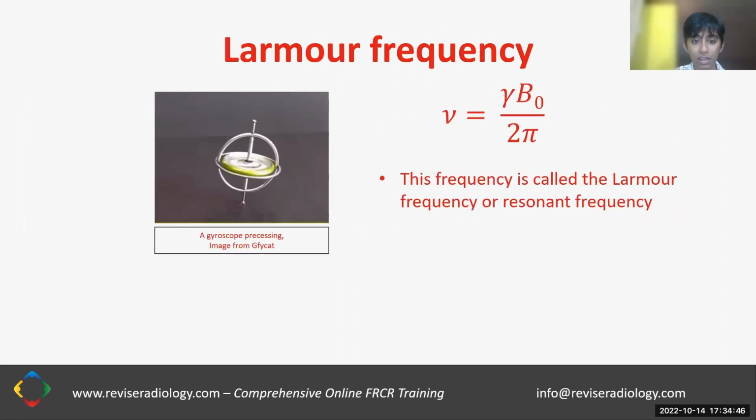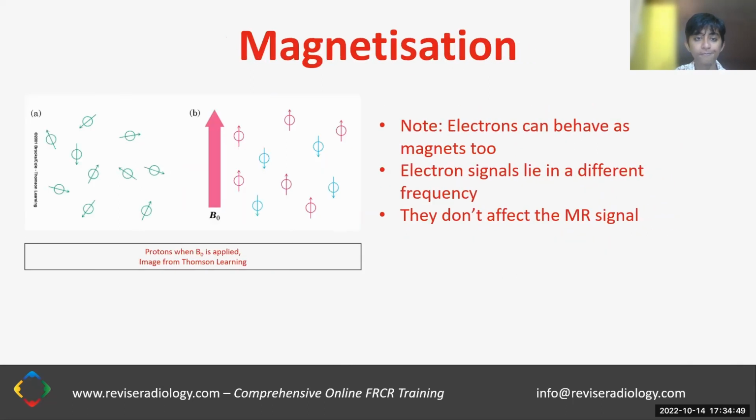Okay, so what happens is we apply a magnetic field. The protons mostly align in one direction, some align in the opposite direction. We apply an RF oscillation, which makes the protons flip up and down in their spins. There's a net increase in energy of the protons. The RF oscillation has a frequency equal to the Larmor frequency, which is the frequency at which the protons are precessing. The RF oscillation is stopped. The protons have a certain amount of energy still left in them. They emit that energy as a signal in a process called relaxation. We measure that signal, and that signal is going to give us a picture of the patient's body, and we'll see how in just a second. But that's what we've discussed up until now.